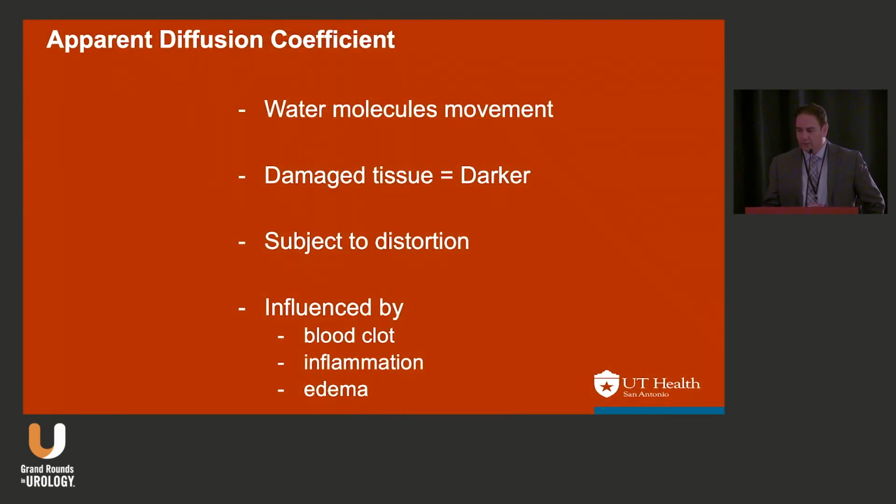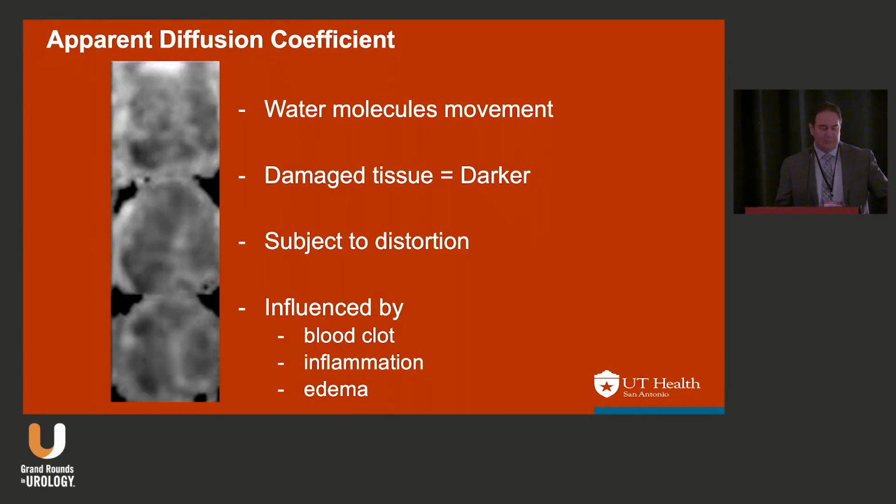When I look at apparent diffusion coefficient, other than our radiology colleagues up here doing an amazing job, what Ralph Klayman would say is, this is a snowstorm over Iowa. Basically, it's really difficult. There are different globs here, and I don't know what's what. When I'm in the clinic trying to show a patient something, it's very difficult to say, oh yeah, that's it. Some of us who read them a lot can do it, but pulling this up in front of a patient, you have to have a lot of confidence to do that.